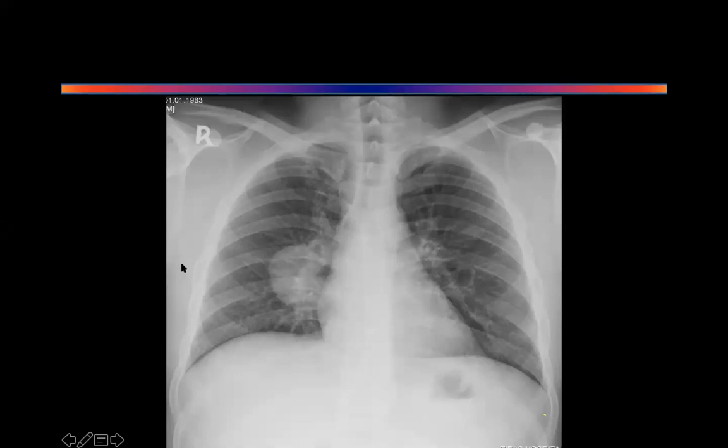Anything else? What about the rest of the lung? Talk about it. You've described this, don't stop. If you're describing that butterfly to me, you have to talk about the background. You have to talk about the garden. You have to talk about the flower on which it is sitting. So talk about this also, no?